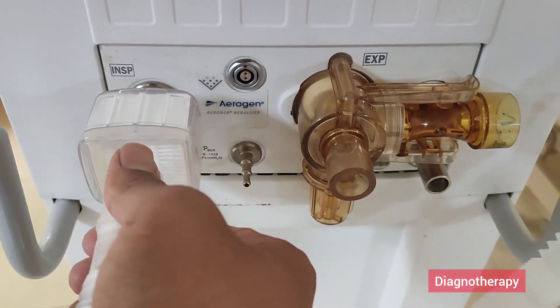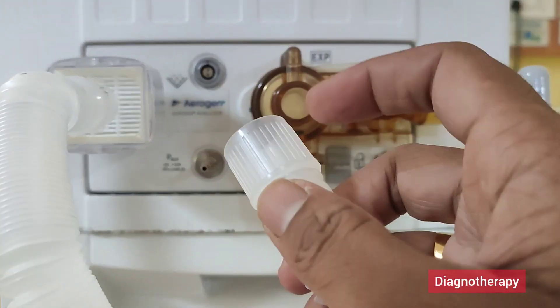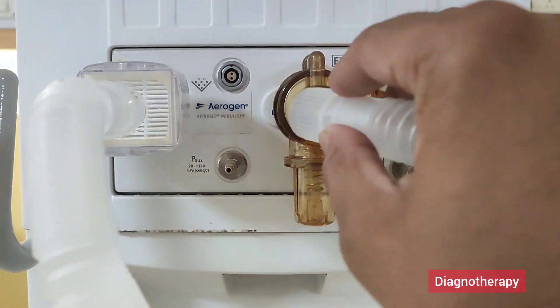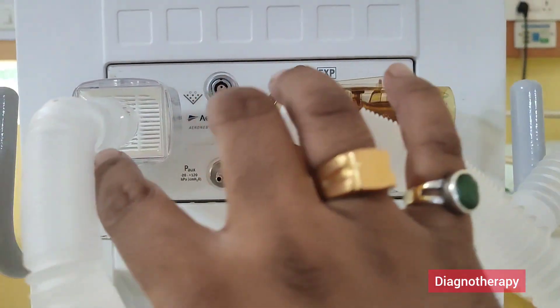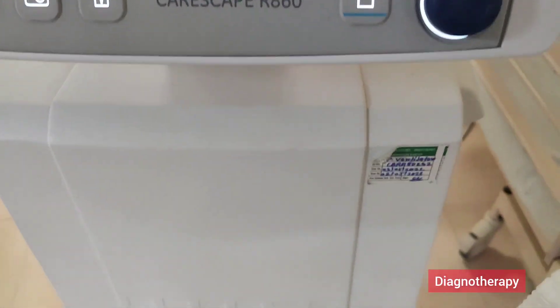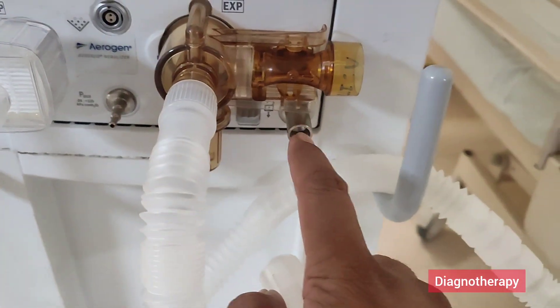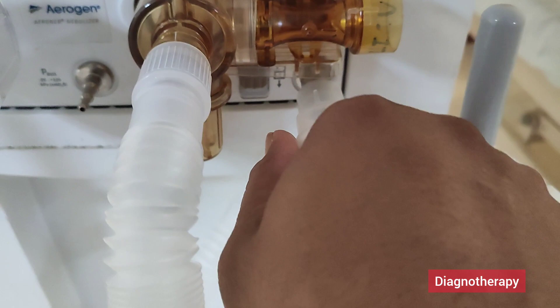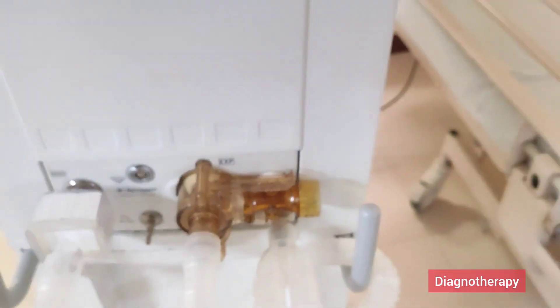Now we are attaching the Y patient limb to the inspiratory port and the second end to the expiratory port. From here the expired gas will be taken, and the reading of tidal volume will be taken from this flow sensor and exhalation valve. This is the front end of the tubing, and it will be attached to the test port for checking the ventilator.